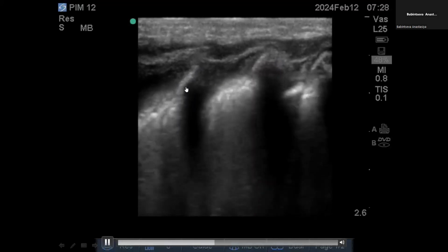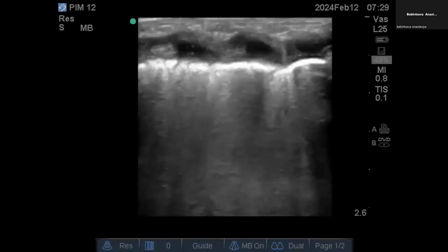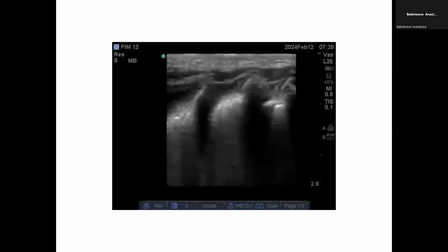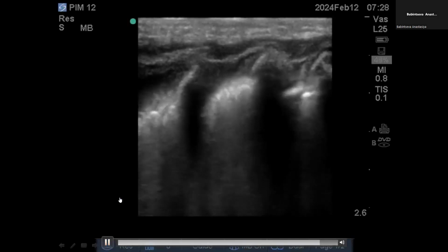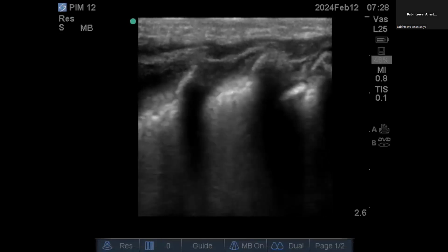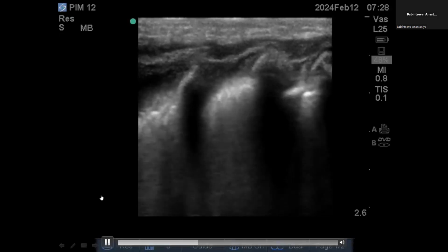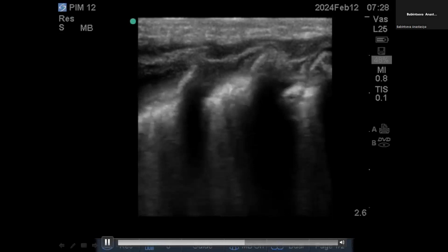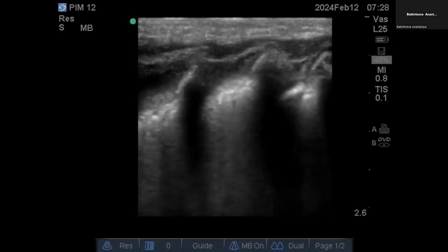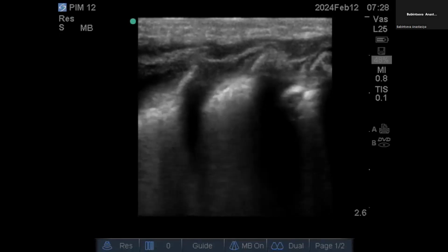My only comment is you're really deep into the image. In this zone, my gut feeling is this is just 2 centimeters? Yeah, 2.6. The challenge is you're losing the deeper lung and the pleura because you're so magnified, which is quite thick, blurred, and irregular with these subpleural consolidations that I can definitely see. If I just compare, I'm going to use my pen to draw.